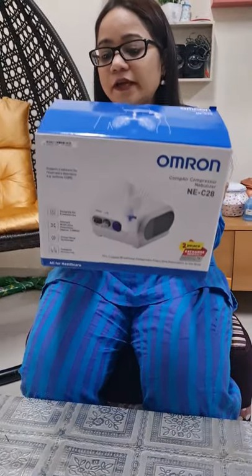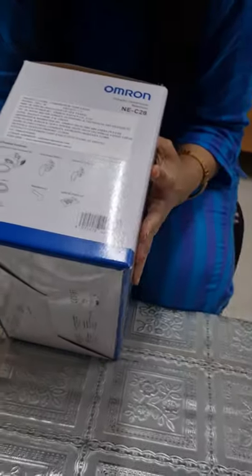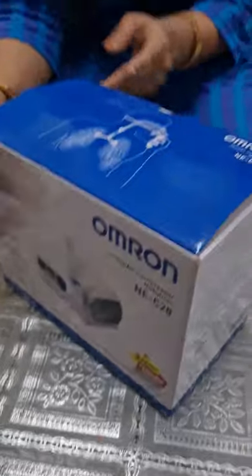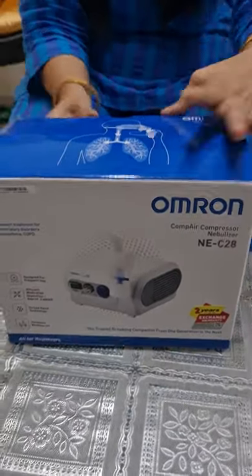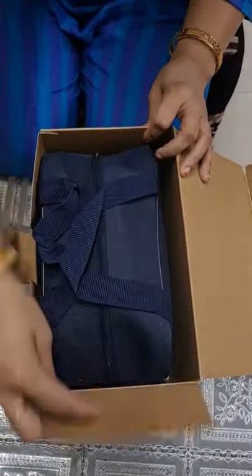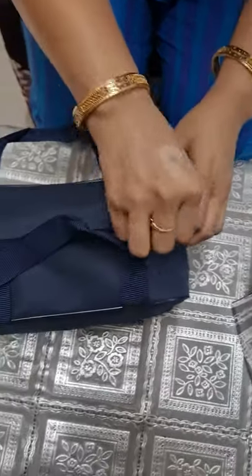We will do the unboxing of this Omron Compact Air Compressor Nebulizer, model NE-C28. Its MRP is 3690 but I ordered it from Amazon and got it for 2349. So let's do the unboxing. This comes in a handy carry bag. You also get the warranty card and the instruction manual is inside.